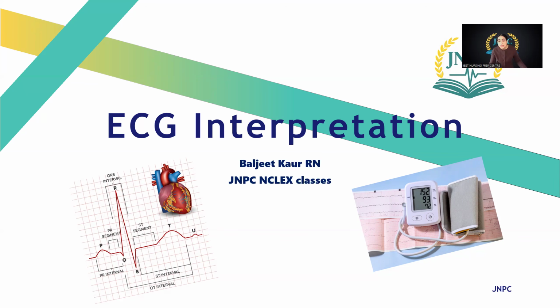Okay. One thing that I want to tell you all before we start is that this class is only for exam purposes. We have lots of other cardiac rhythms that you will see in day-to-day life. But in the exam, what they are expecting you to know, we are only going to focus on that. This is not a class where you will become fully competent to work as an ICU nurse.